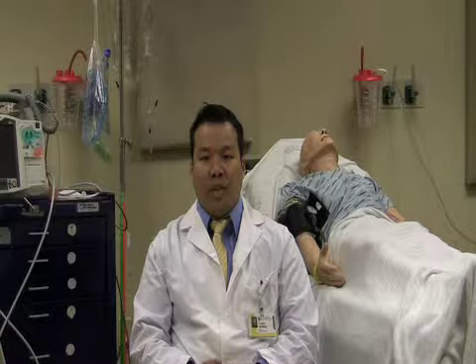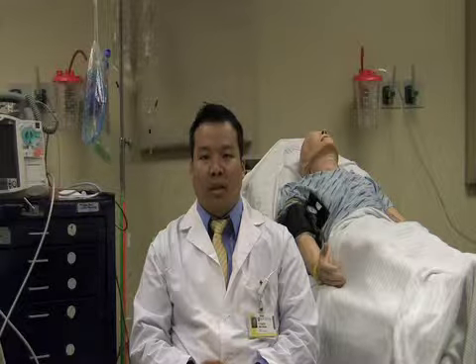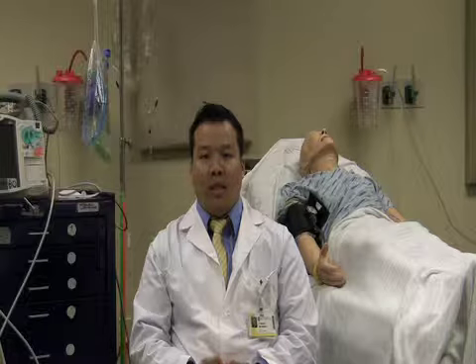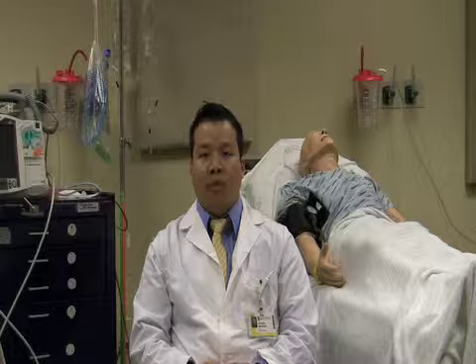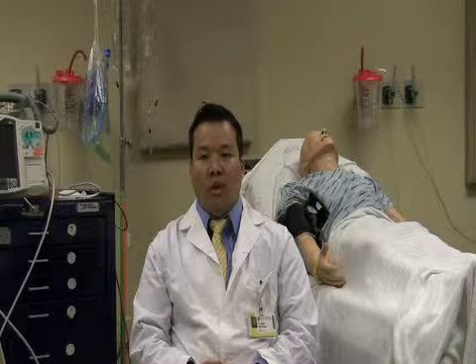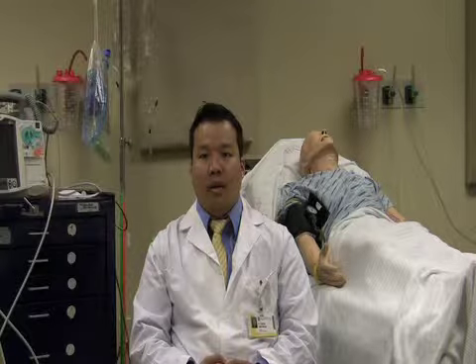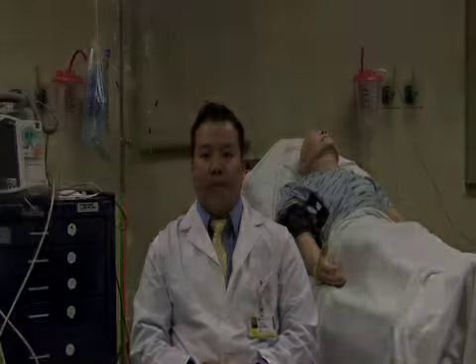In these patients, they can prophylactically be placed on pacing pads, given the concern that these pacemakers may not actually function. In addition, a rhythm strip should be printed out to look for the heart's underlying rhythm, as well as for any pacemaker spikes that may not be followed by a QRS complex.